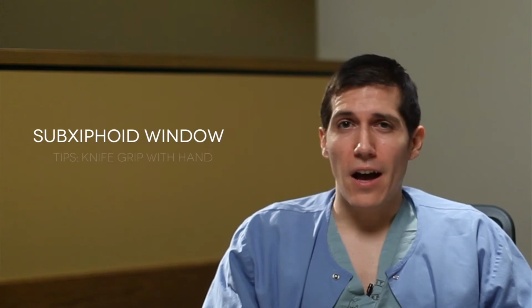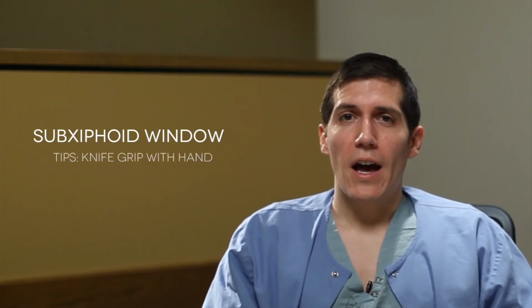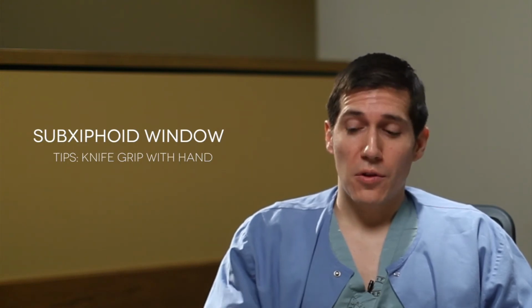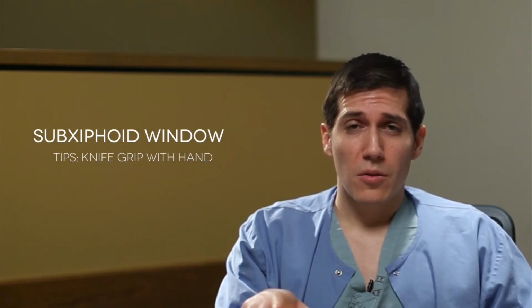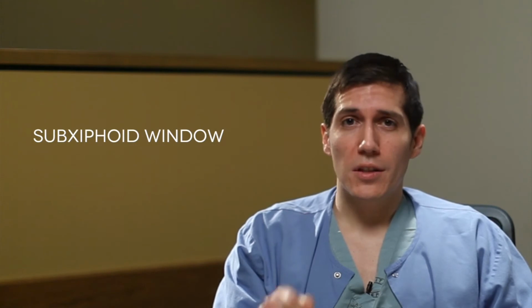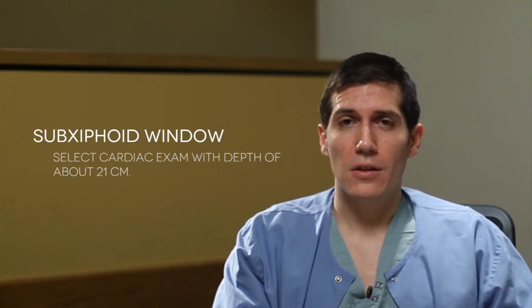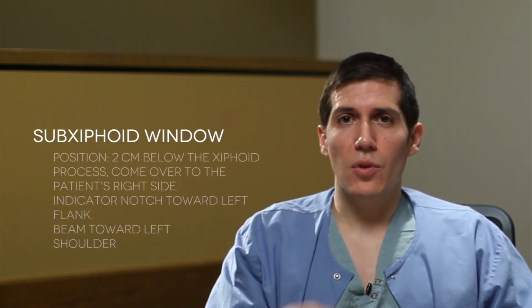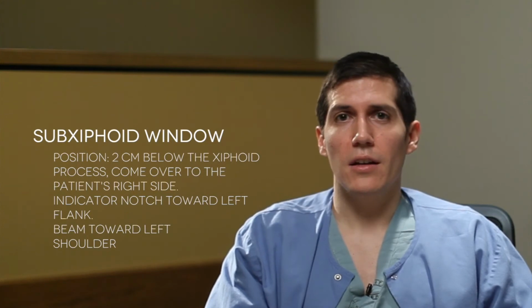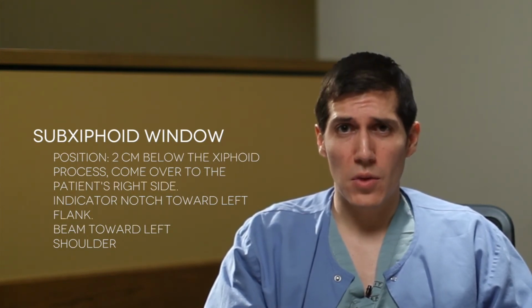Finally, tips on how to get your best images from the subxyphoid window. Remember, you want to have a knife grip with your hand, not over the top like the pencil grip, but in a knife-like grip. That way you don't get in your own way. You want to select a cardiac exam with a depth of approximately 21 centimeters. Remember, the position is a little bit different. You're going to go about 2 centimeters below the xiphoid process and come over to the patient's right. You're going to 2 centimeters as well.